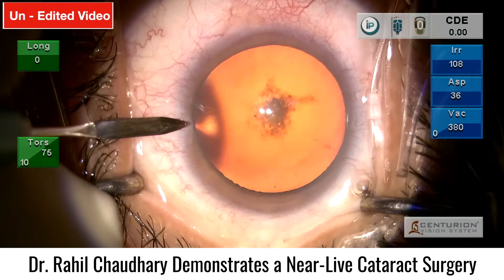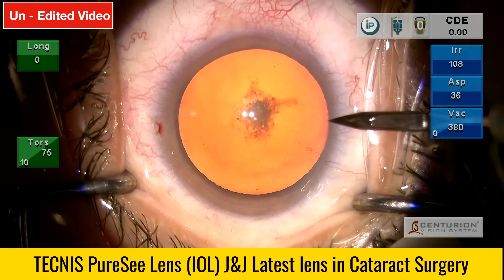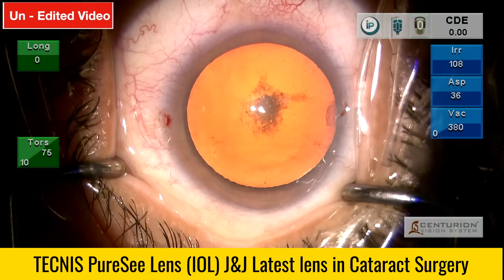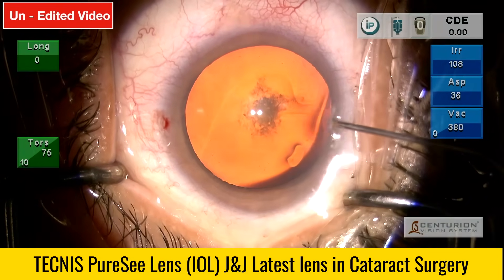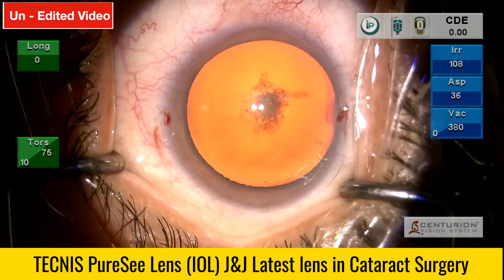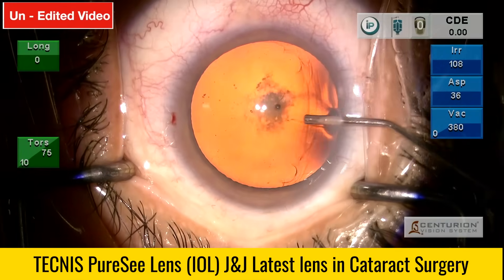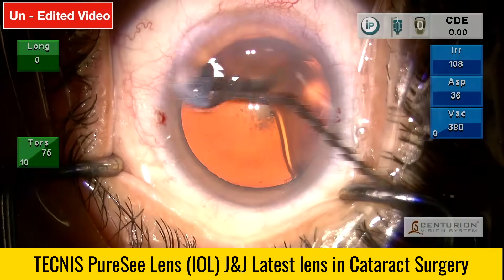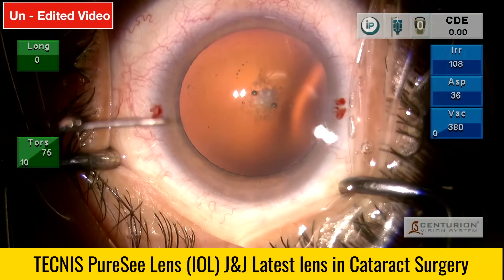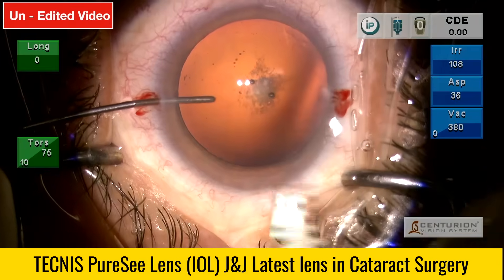We are using the PureSee IOL, which is the latest EDOF category of lens from Johnson & Johnson. We will be using the non-toric lens for this procedure as total K is minus 0.17 diopters at 99 degrees. Using a temporal incision, the power going in is plus 24, calculated with the Barrett TK Universal tool. Surgically induced astigmatism is 0.2 diopters. The grade of cataract being operated on is grade 1-2 with PSC.